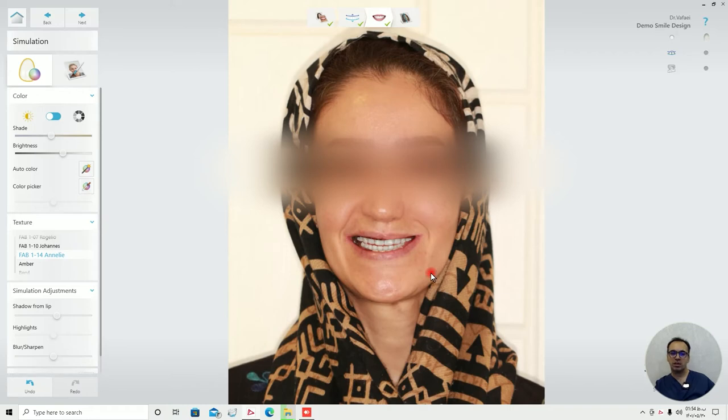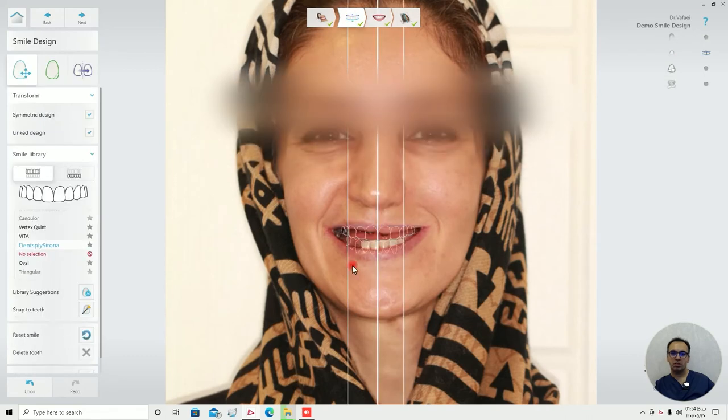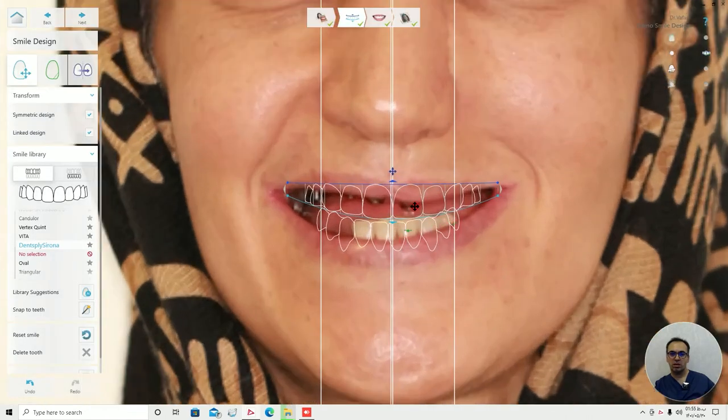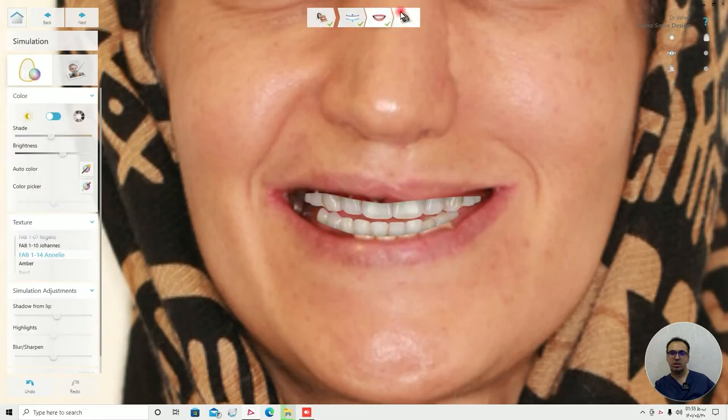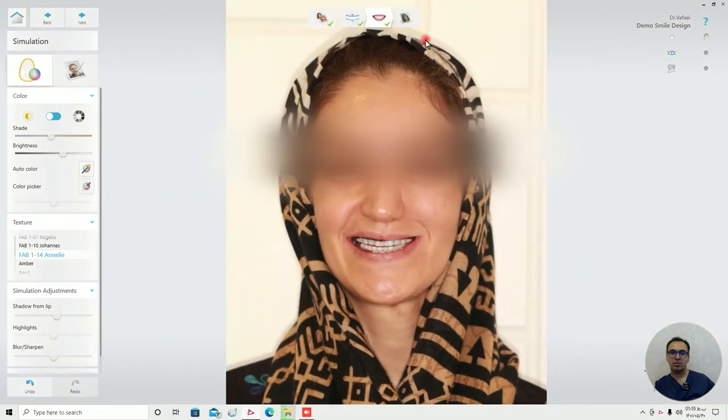And most of the time, maybe we need a little bit of a tweak — maybe a little bit. The small details make the test look far better.